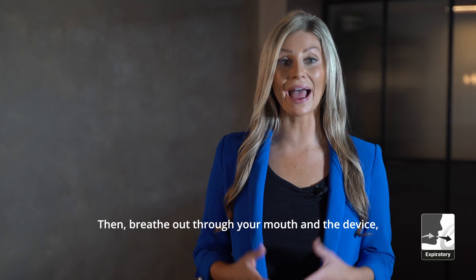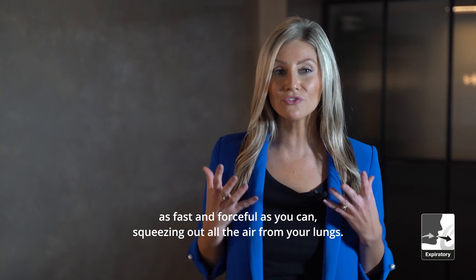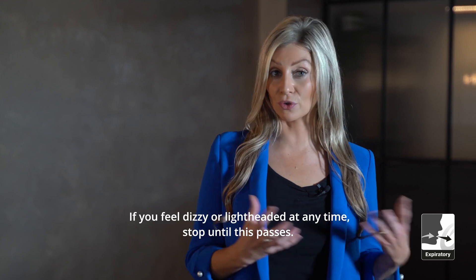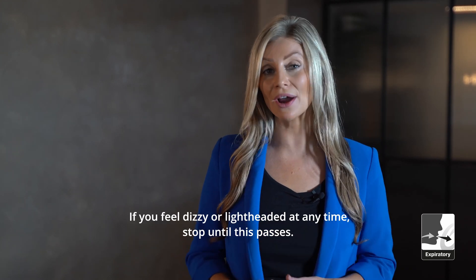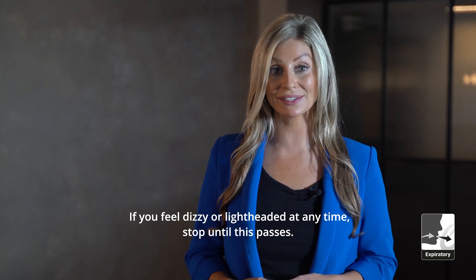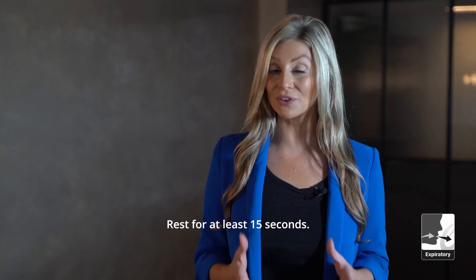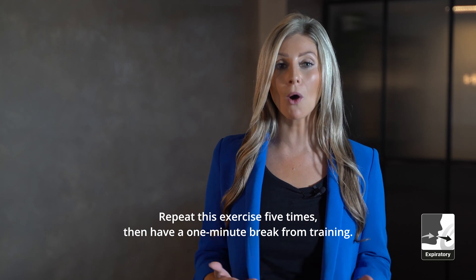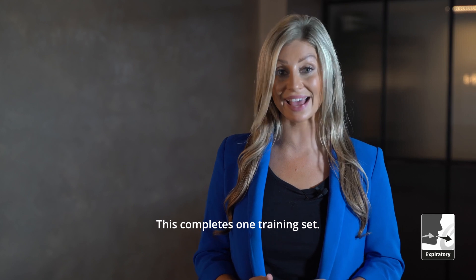Then breathe out through your mouth and the device as fast and forceful as you can, squeezing out all the air from your lungs. If you feel dizzy or lightheaded at any time, stop until this passes. Rest for at least 15 seconds. Repeat this exercise five times, then have a one-minute break from training. This completes one training set.